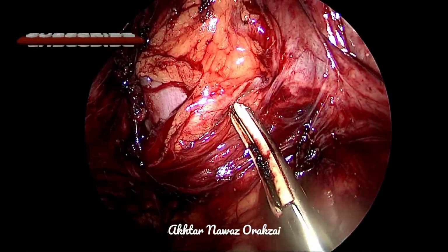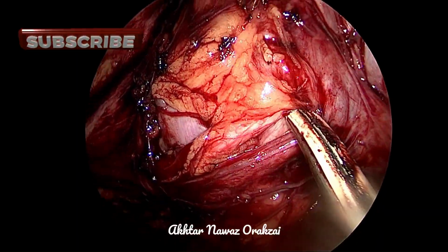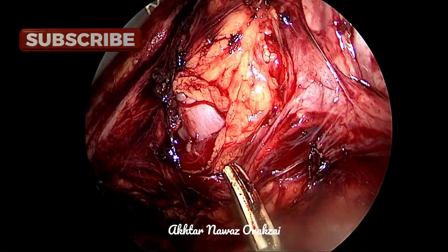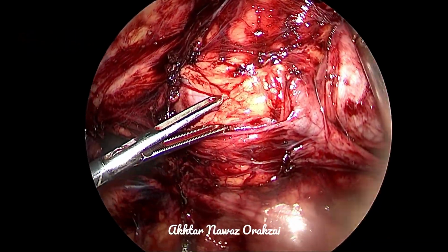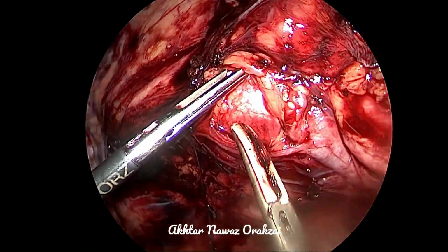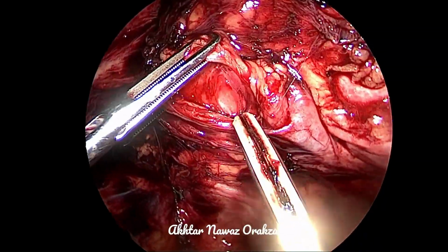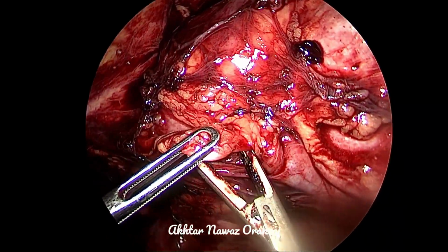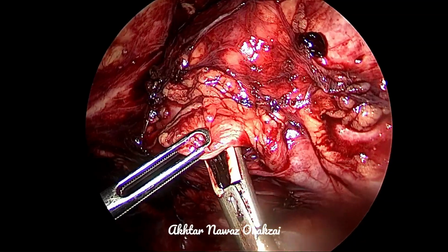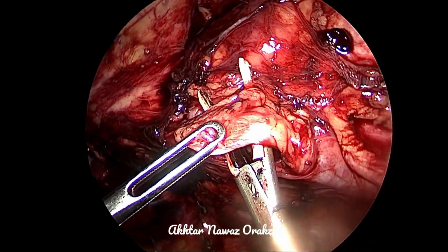Remember the principles of pyeloplasty. The same principles apply to the horseshoe kidney as well. So mobilize the ureter to the minimum, and mobilize it with the periureteral sheath in order to preserve the blood supply to the ureter, so that devascularization is avoided.